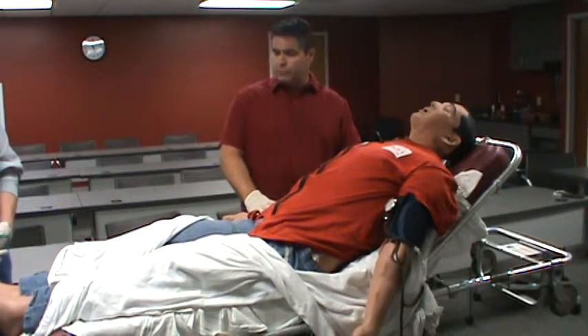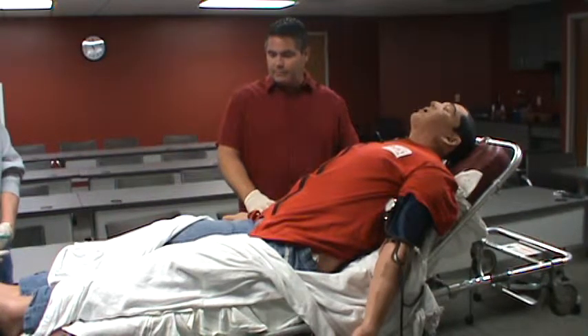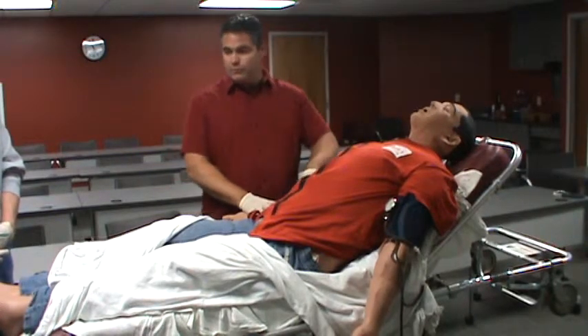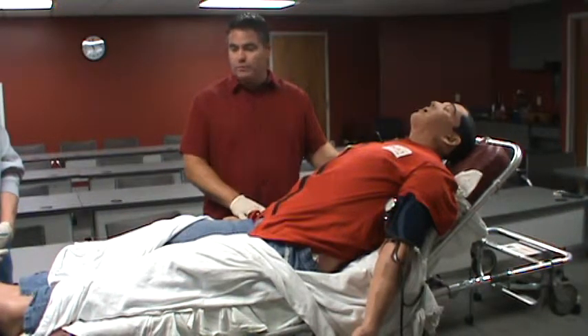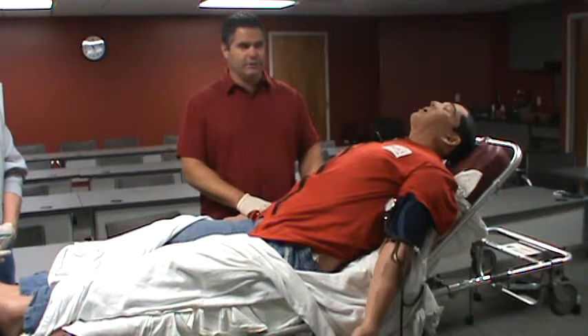Before we get started, there are some ground rules with the simulator. First and foremost, we're going to treat him like a real patient. He is pretty durable — he's not a rugged Ron if you're familiar with the fire service — but he also has some fragile points. His elbows are the easiest part to break, so as we go through the simulation process, if you're moving him, we're going to take utmost care making sure that his elbows stay intact and we don't tear his arms off.